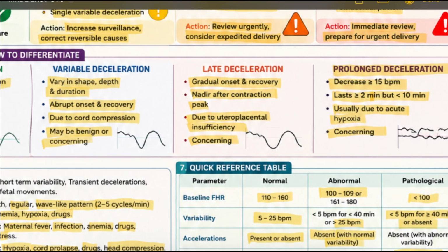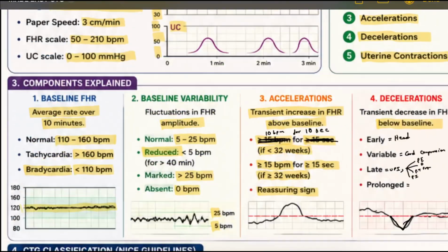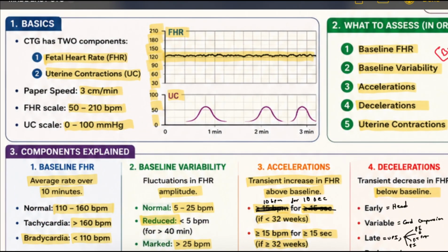And if everything fails, then at last we have to do C-section. Okay, so these are the things. Mostly we covered everything in CTG. So this is CTG episode 1 in the obstetrics and gynecology series.